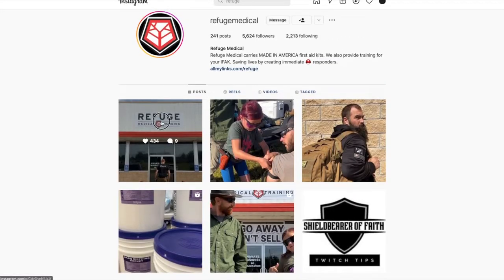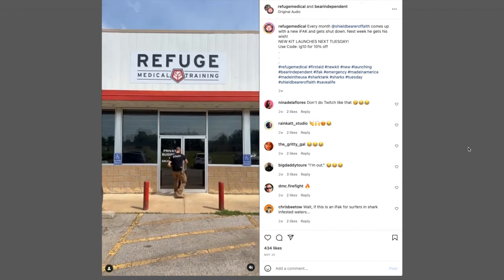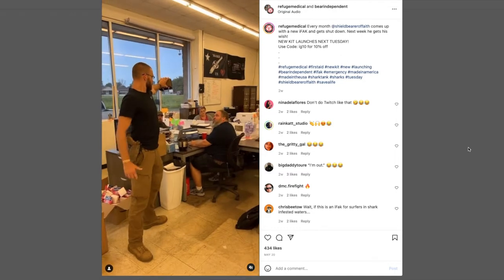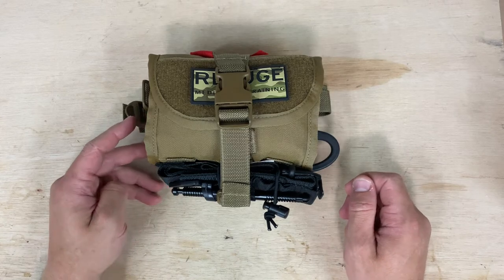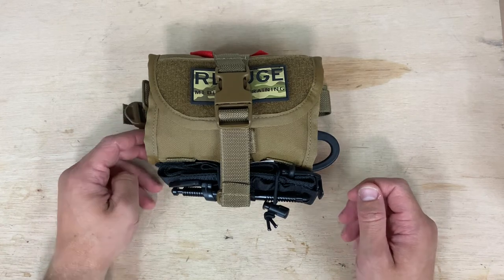So from the website, it was developed by a fellow named Twitch, who was their lead instructor over there at Refuge Training. It's meant to treat one to two casualties with the MARCHE algorithm and can be utilized in an IFAKs role. It has a soft tourniquet on the outside there, and maybe a bit of a play on words there with symbolism with ARC. So I like that.